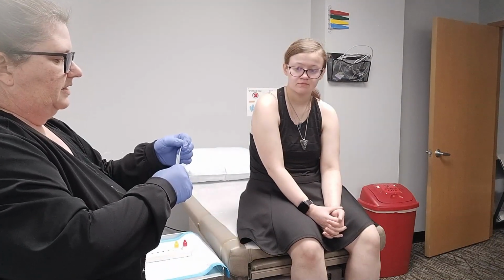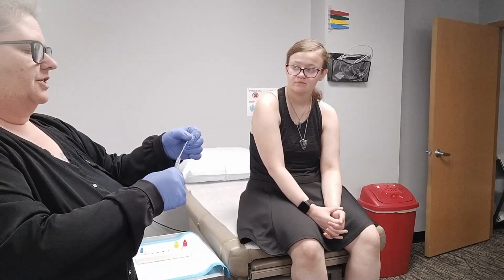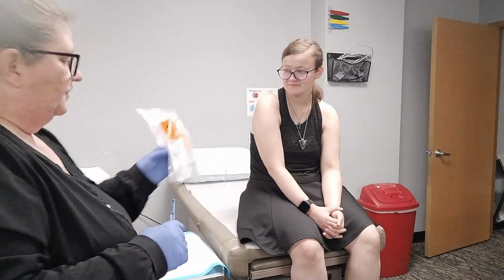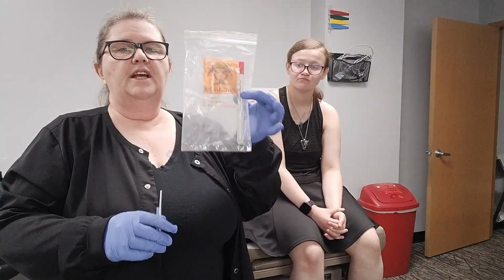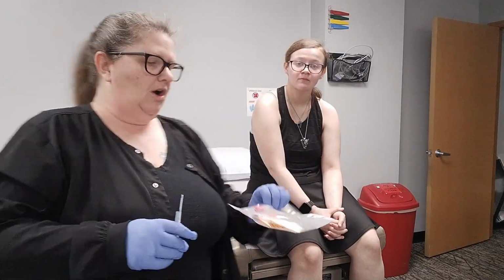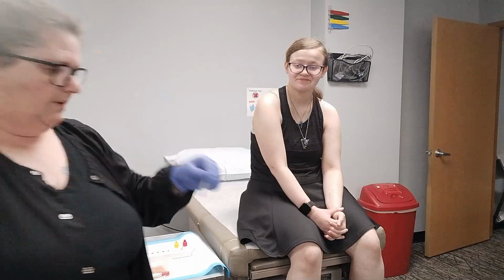We'll go ahead and take this guy. We have got one line, but not another. One on top, not on the bottom. So therefore, she is a negative. However, if the provider goes ahead and orders it, this will go out to the lab and a culture will be done and we'll have results in probably about 2 to 3 days. All right. And then we will go ahead, again, this will go into biohazard.